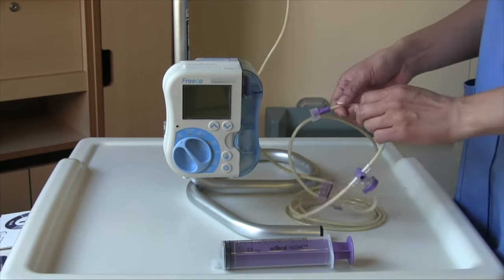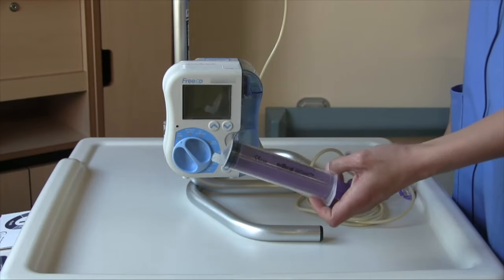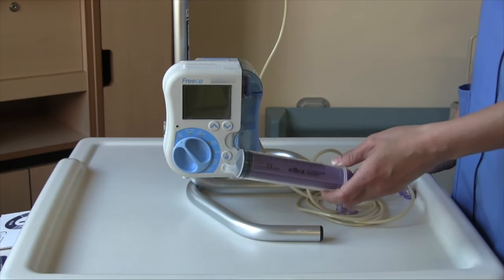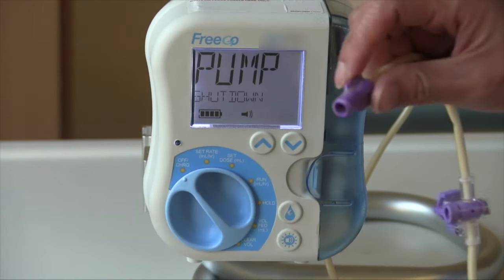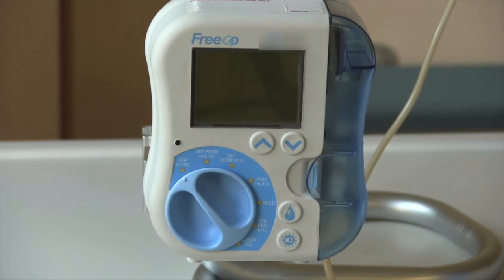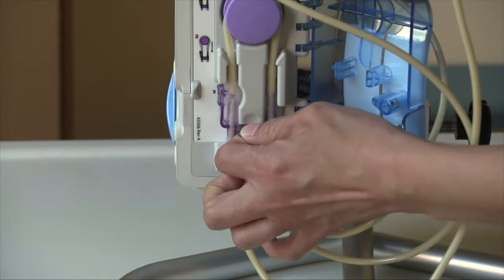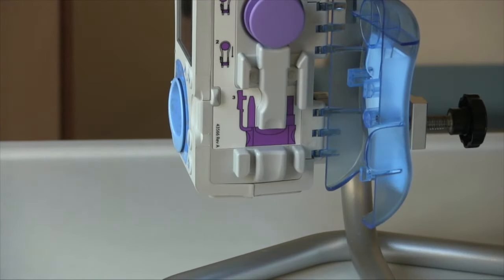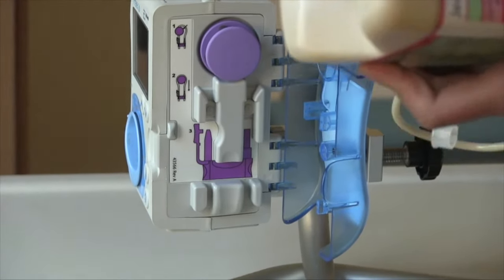After you have turned your machine off and disconnected your giving set from your feeding tube, flush your own feeding tube with water. The amount of water that you flush will be outlined in the regime given to you by your dietician. Flushing your tube with water after your feed is done will help prevent blocking of your tube. Once you have turned off your pump and disconnected your giving set, you can take out your giving set. Gently lift up on the clip to open the door and use the clip on the tube or the tube itself to lift the giving set off the pump. Place the giving set and the feed bottle in the bin. Once you have opened your bottle, it has to be used within 24 hours. A new feed bottle and a new giving set is to be used daily. Remember to attach your pump to your battery for charging.